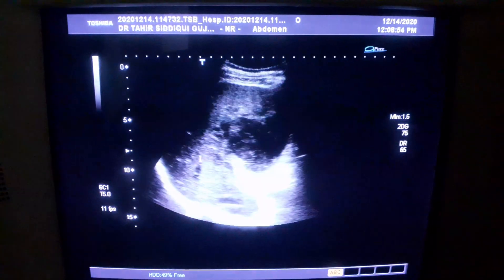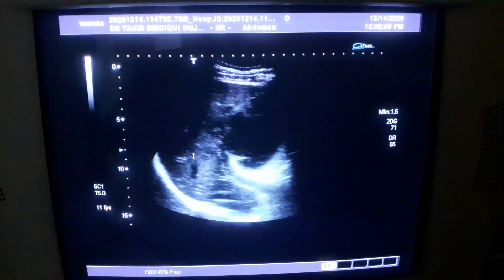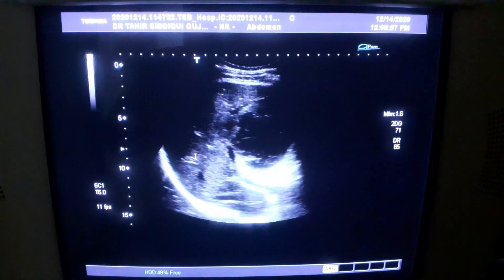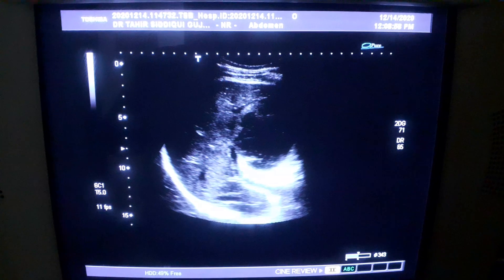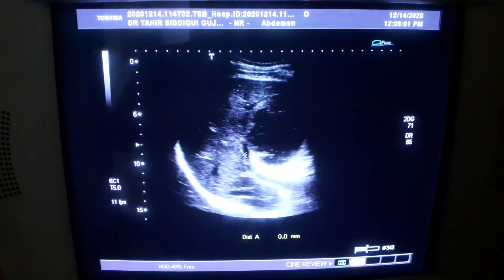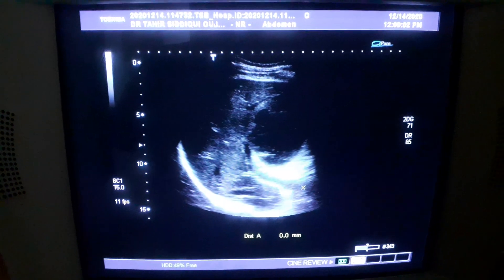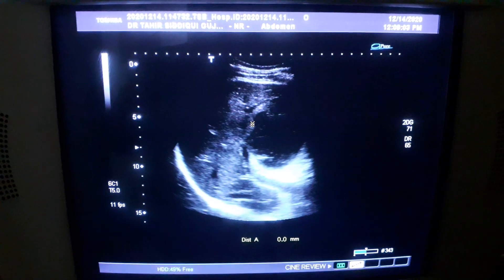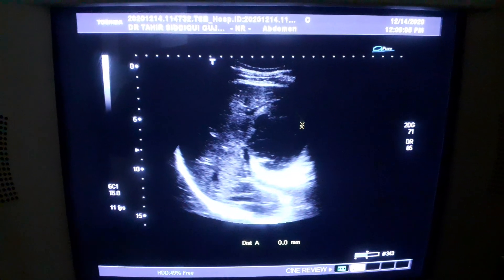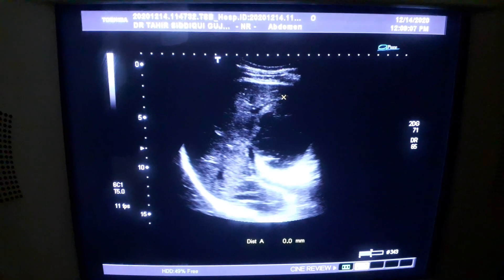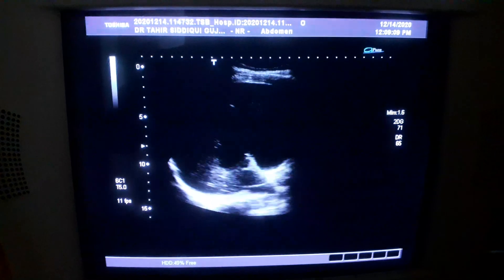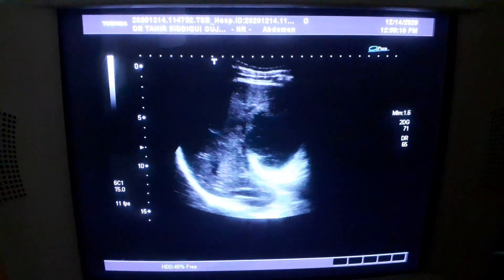This is an ultrasound of the liver. You are seeing the portal vein. This is the portal vein, and there is a cystic area anterior to it in segment 4B of the liver.